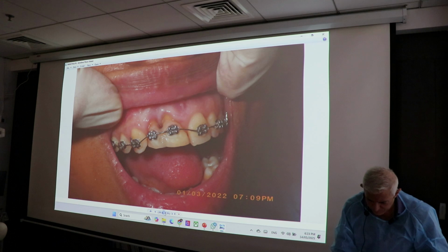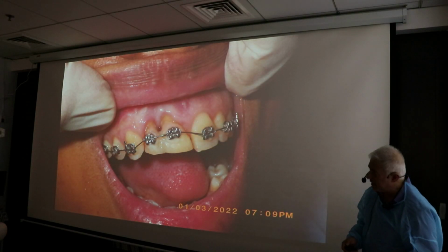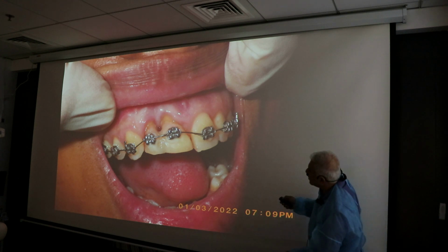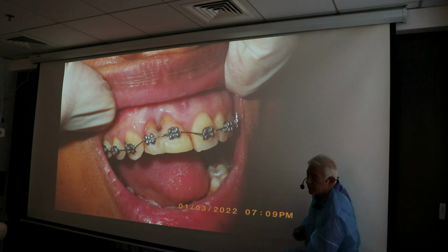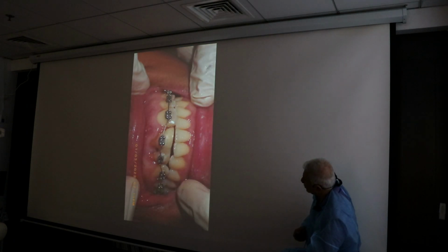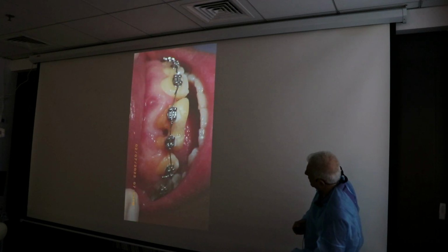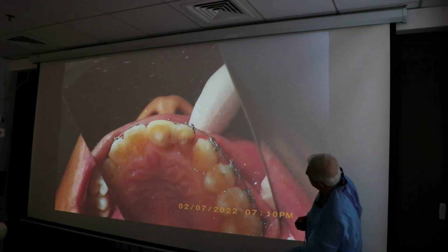Okay, as the time goes by, you can watch the dates. You can see how that thick soft tissue actually is not where it was, it's where you pulled it. Can you appreciate the thickness now? It wasn't like this before. So now the soft tissue is in our favor. Anyway, you can look like that for a while.